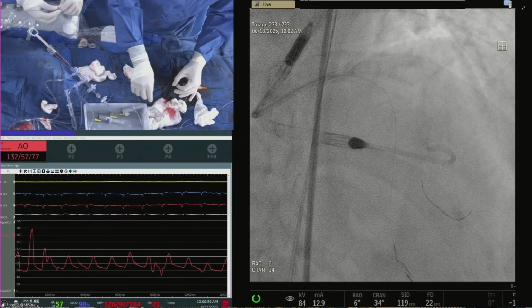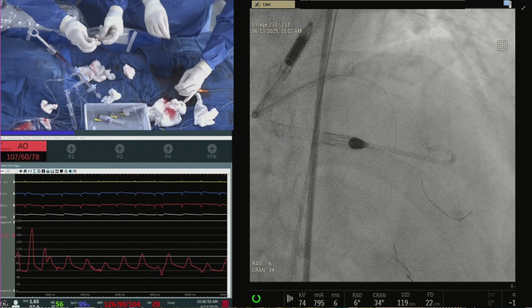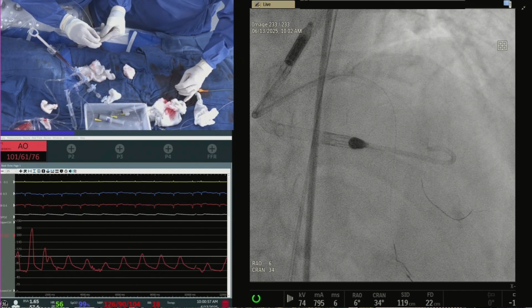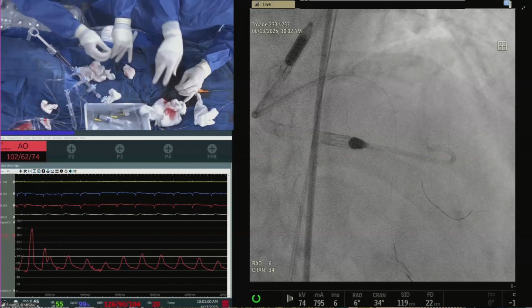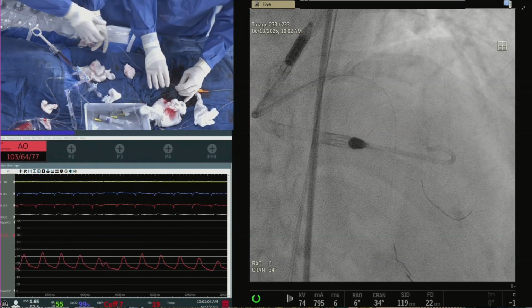Good. You know, an important bifurcation and long calcified lesions, I mean, this is the sweet spot for intravascular imaging. I think both imaging and future... Okay, but everybody agrees we are going to do the balloon and then we get the IVUS ready? Yes. We have? Yes. Okay. Yeah, we have.